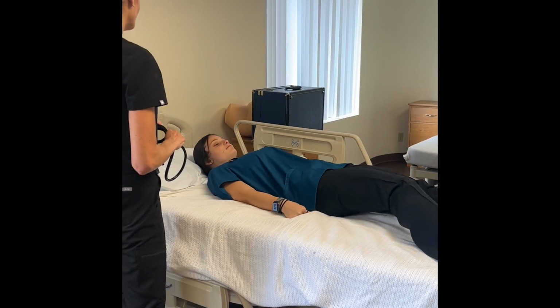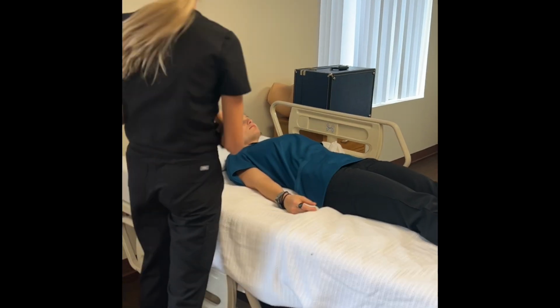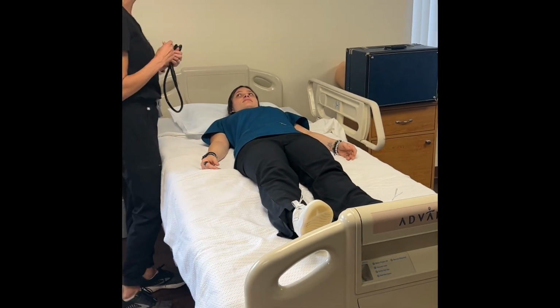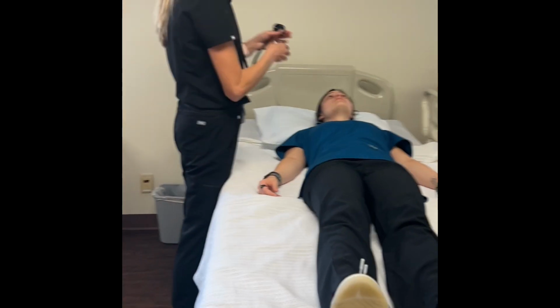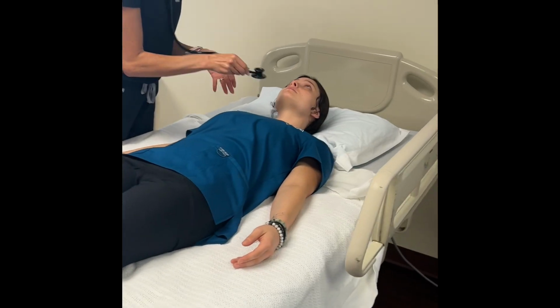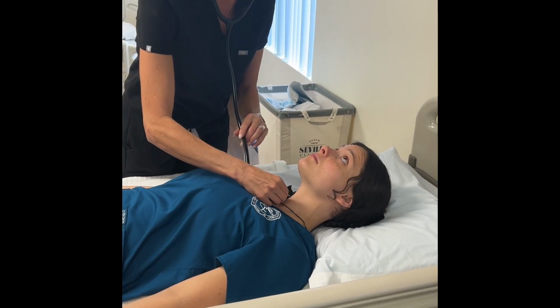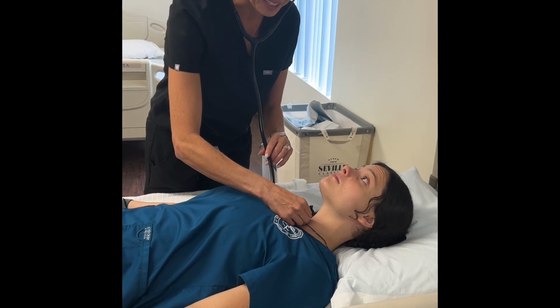And then I would go ahead and I would listen to these cardiac sounds again because some heart sounds are positional, but because I did them correctly, I'm going to skip that. And I'm going to move to the arteries. So I'm going to be starting by listening to your carotid artery. If you can point your chin towards the ceiling, and I'm going to listen to your left carotid and right carotid. And I hear breath sounds, but I do not hear a bruit, which is what I'm listening to rule out.